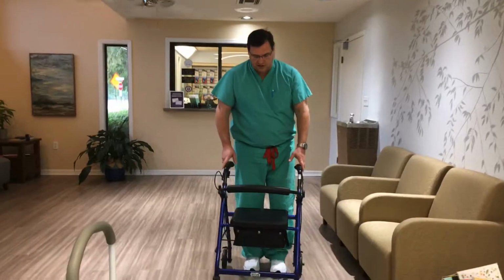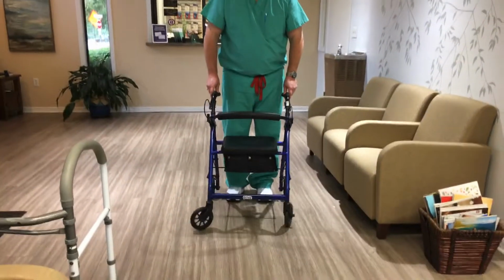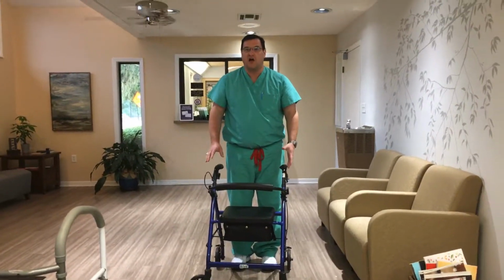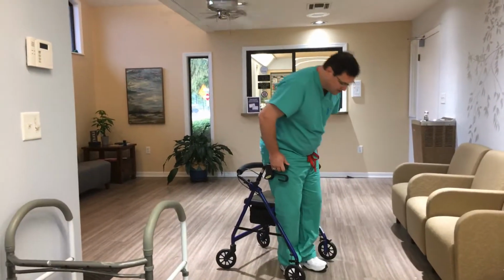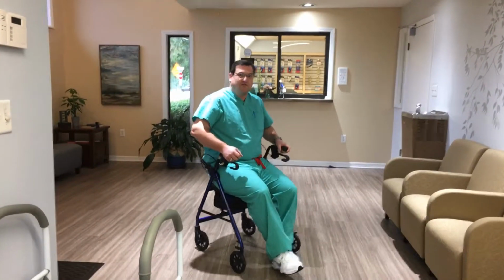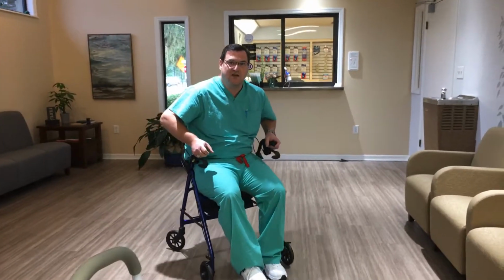And today I wanted to talk to you about the proper use of a walker in order to be non-weight bearing. So the first thing I wanted to demonstrate is the walker that I'm not super happy using to be non-weight bearing, which is a walker that has wheels and basically a brake, because what it requires is a lot of coordination. Now, while it might be nice to have the walker that has wheels and sit on it, and some people will sit on it and scoot around like this in order to keep weight off of their foot, that's fine, okay?